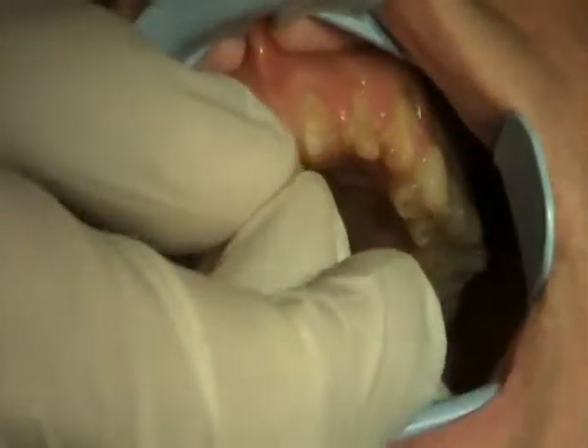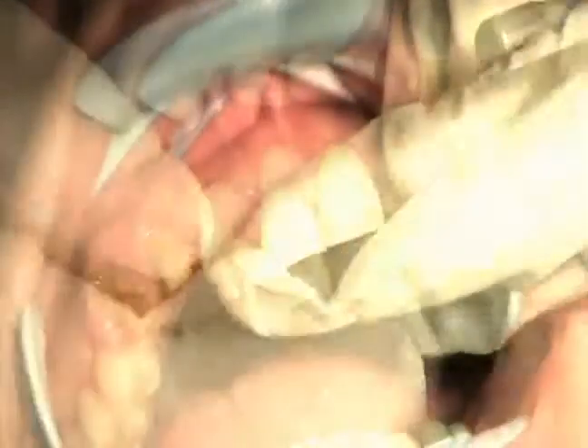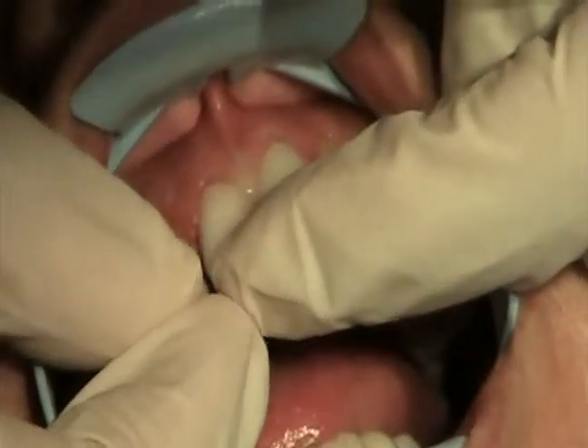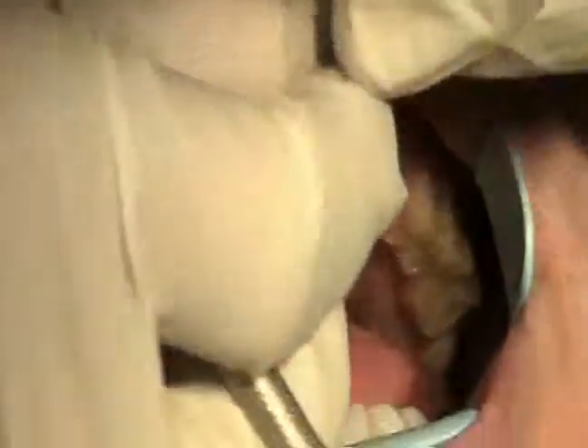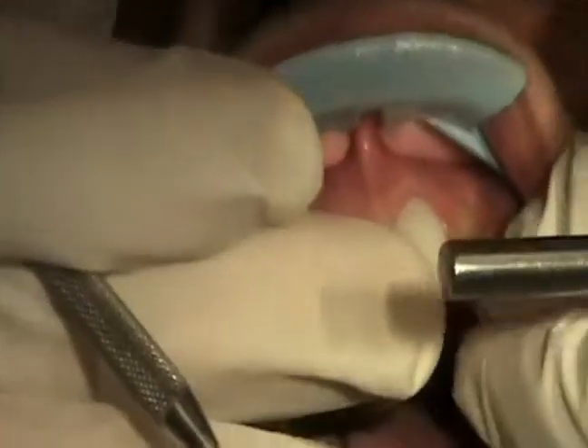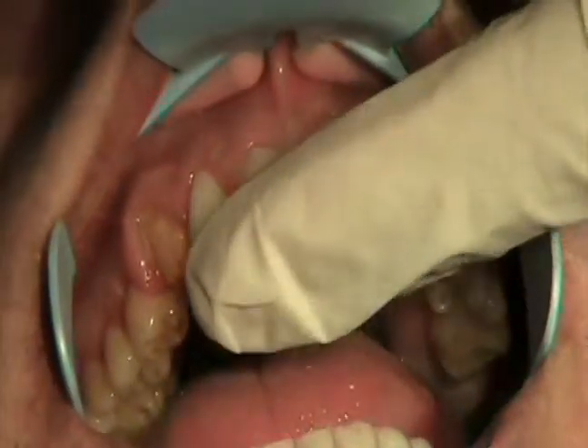The big day has come and we've taken his temporaries off. We're going to go ahead and try in those new crowns. At that point, we want to make sure they look good before we consider cementing them in. Looks like they're coming along quite well there.